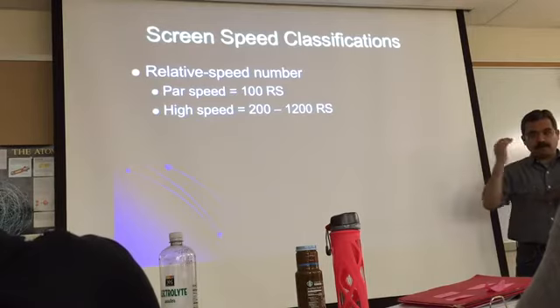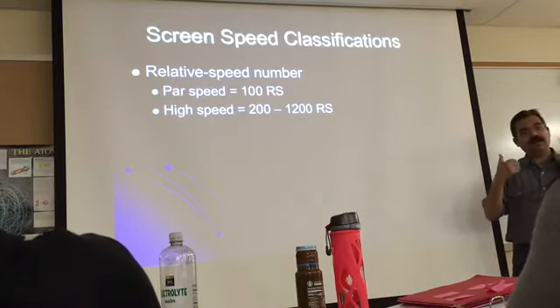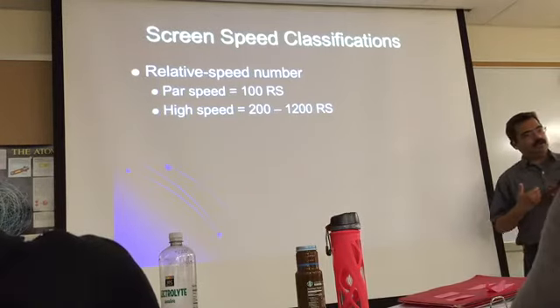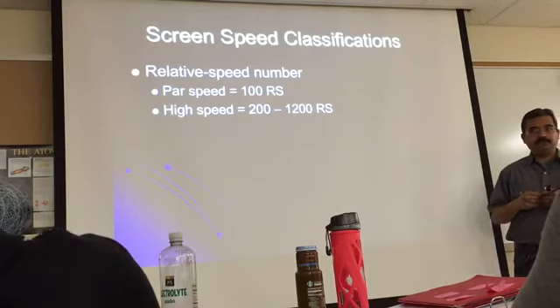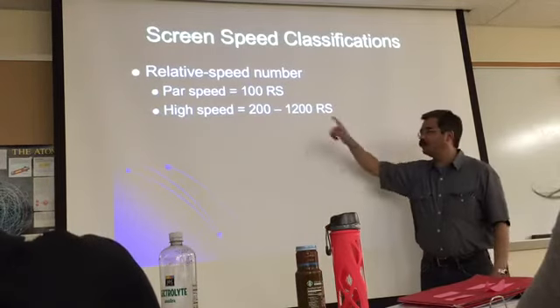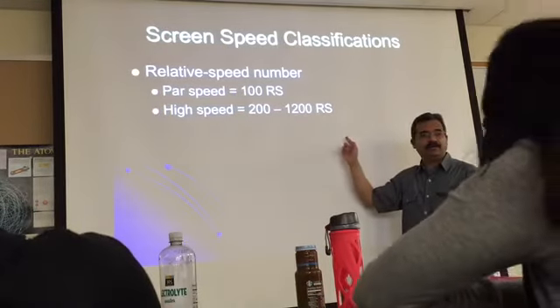It's very quickly. When you're doing that, and you're doing that rapid frequency of films, you need something that can respond as quick, and that's one reason why they use the 800 speeds or higher, the 1000 RS speed.